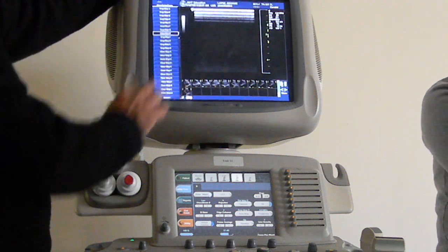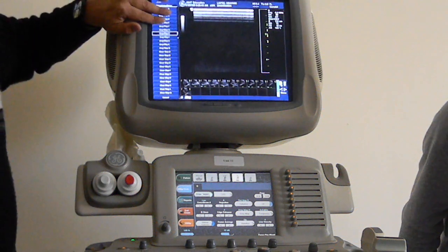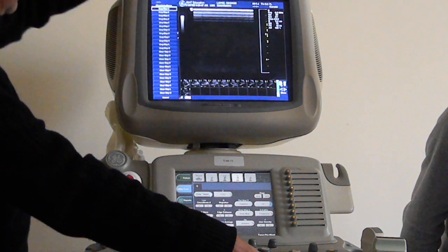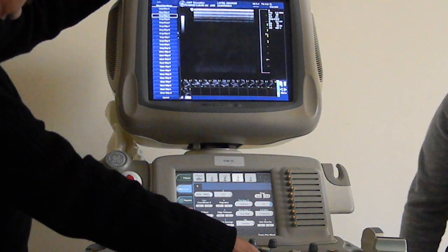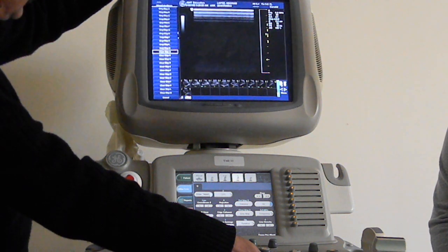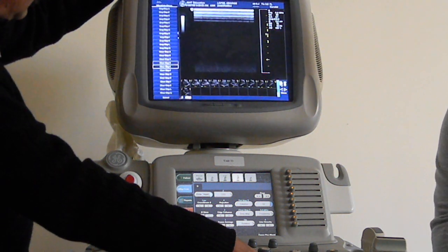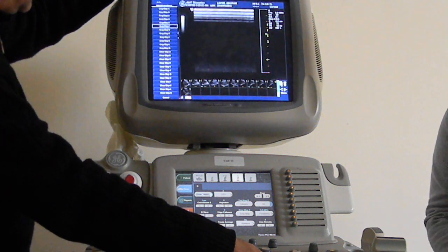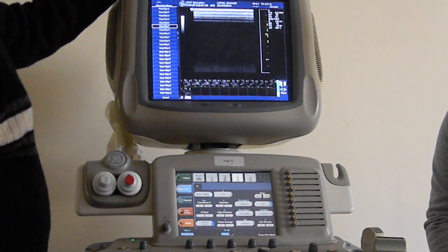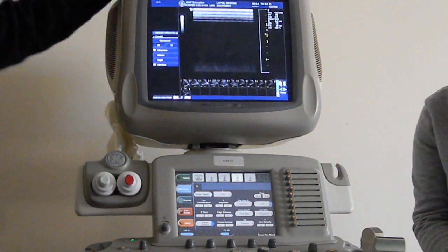Now this is your slot, and you say, how do I move it up and down? This is not a touch screen. Your mouse. If you look closer at the map here, it slightly changes as you move up and down. So you can choose different maps. And when you get to a map that you want to go with, right click and here we go.